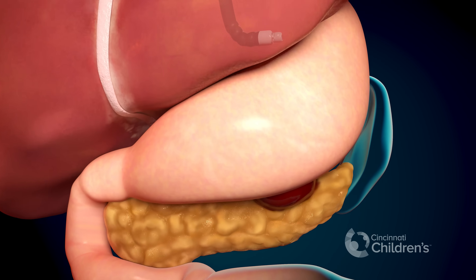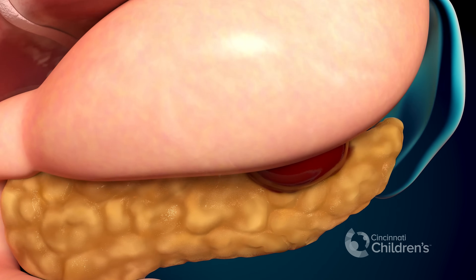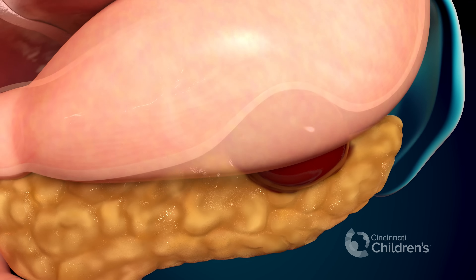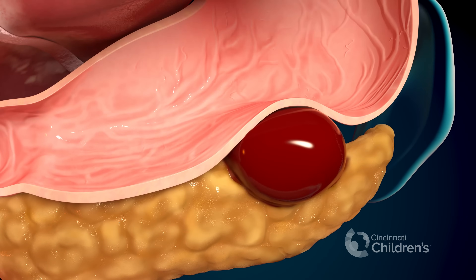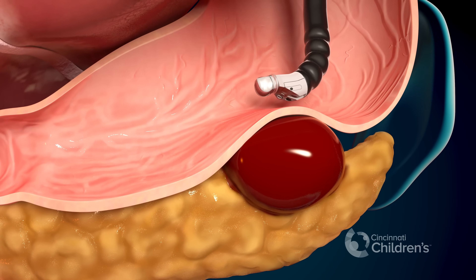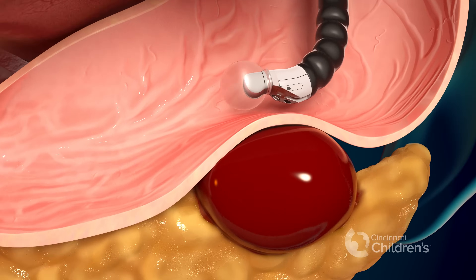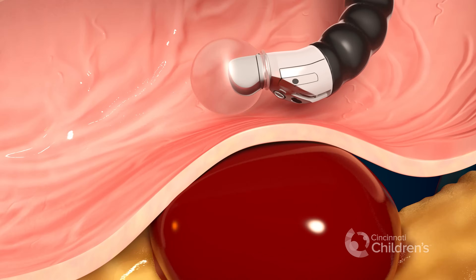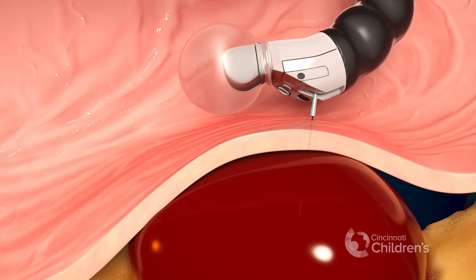In addition to biopsies, endoscopic ultrasound guidance can be used for drainage of pancreatic pseudocysts or walled-off pancreatic necrosis, along with other intra-abdominal fluid collections. Here, a needle is passed through the stomach wall into a pancreatic pseudocyst, followed by a wire through the needle.